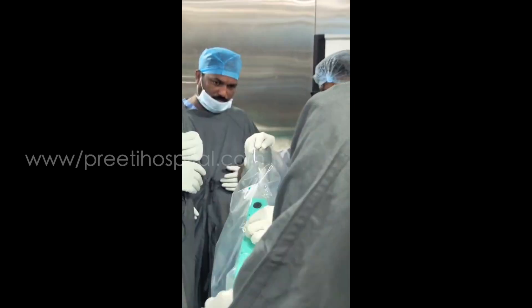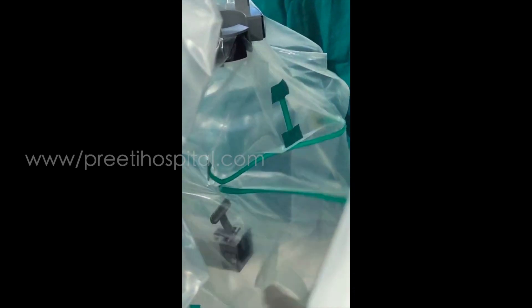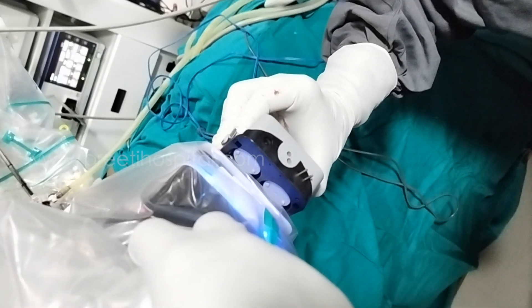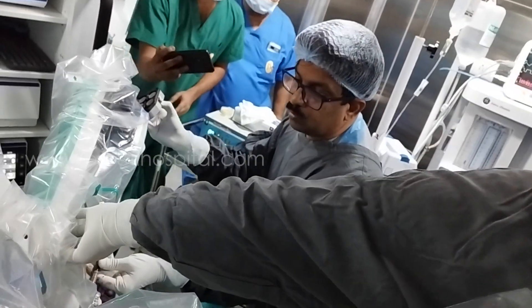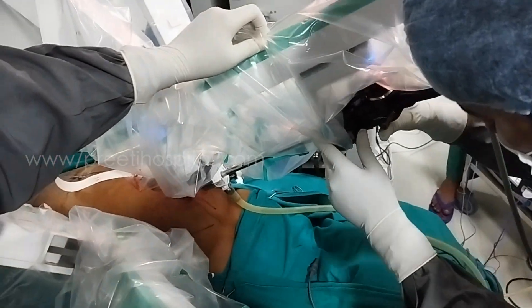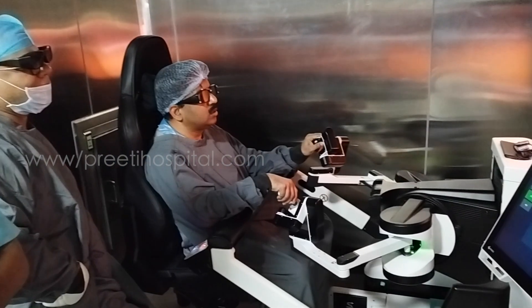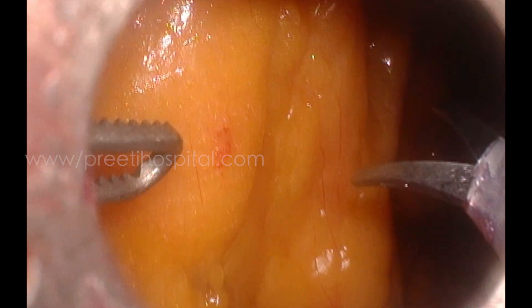I myself did all the docking, as it is better to learn this initially. We have a four-arm SSI Mantra, but in this case only three arms are used. The draping is not difficult to learn. The camera is an Olympus HD camera with 3D view. We inserted the right-side scissor and left-side grasper instruments, with the center being the camera. We checked all movements — there is no clashing. This is the open console system with all three arms at the lower end of the patient.